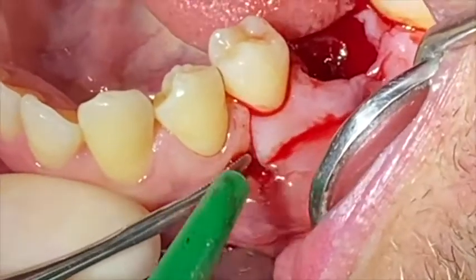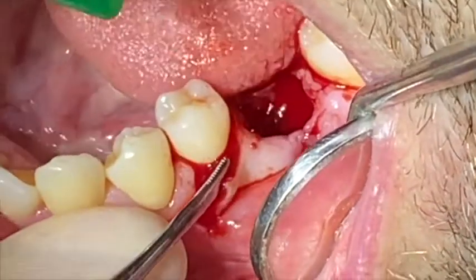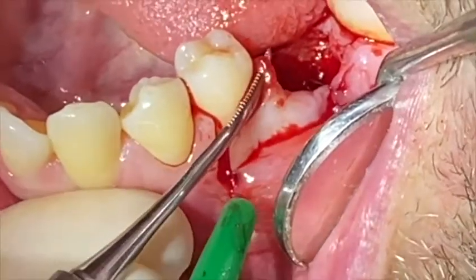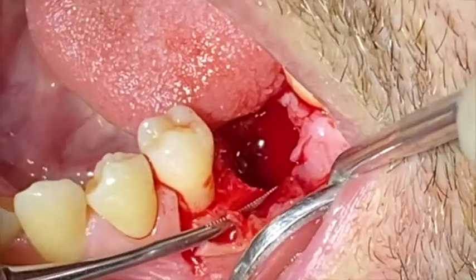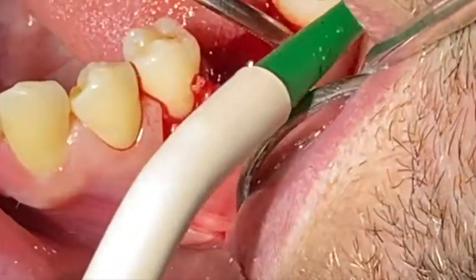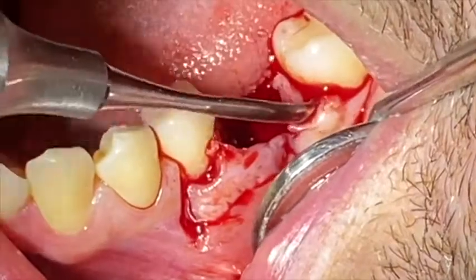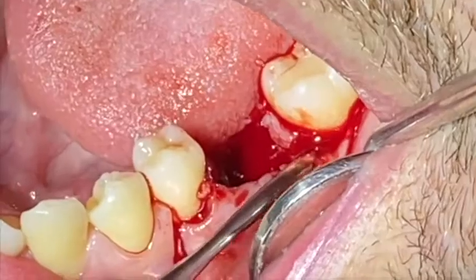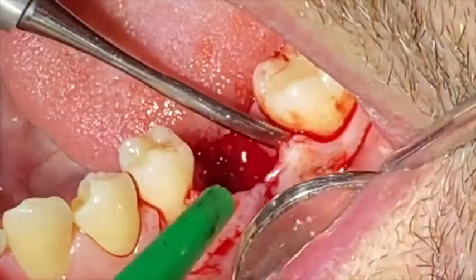I'm going to very carefully, using periostomes and microsurgical instruments, preferably reflect this flap as long as I have underlying bone. Where I don't have any underlying bone, since I know that there is a cyst connecting the inside to the inner flap to the outer flap, and this area is very, very thin, I'm going to start by reflecting the papilla and the attached gingiva. I need to have support and feel the support of the bone.